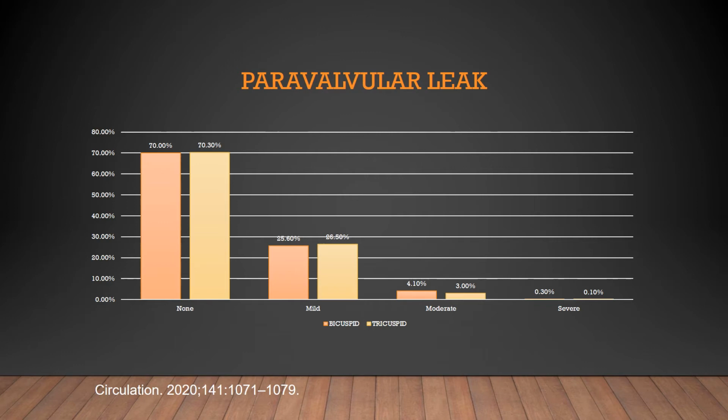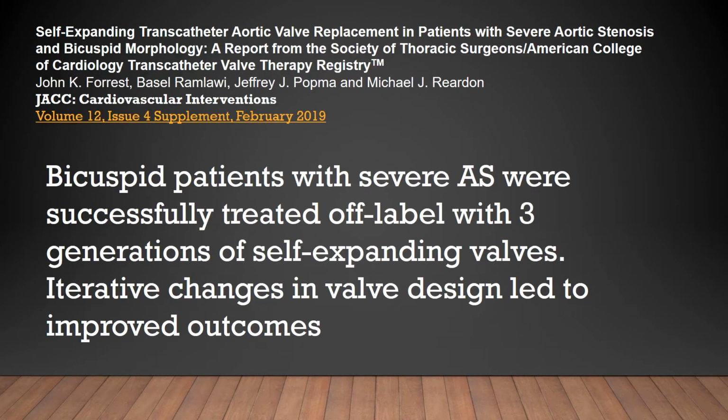Again, is there room for improvement for paravalvular leak, not only for bicuspid but for tricuspid valves? Absolutely, yes. And as newer generation valves come to being, this certainly will be a problem that I'm sure will be addressed and be taken care of.